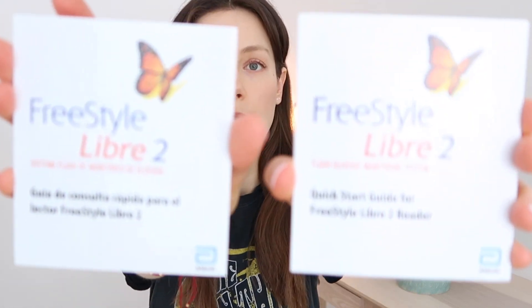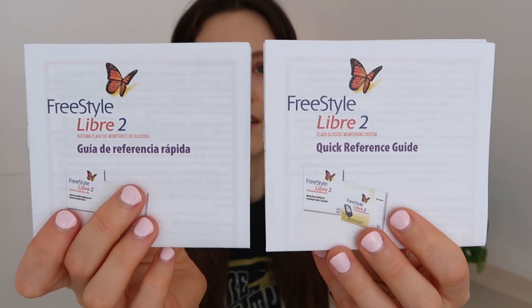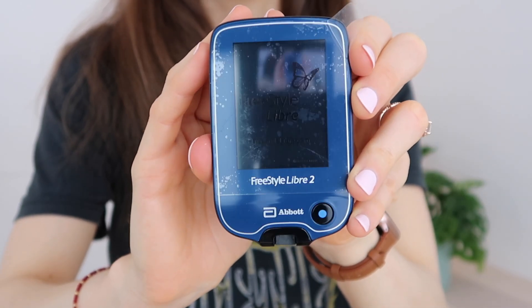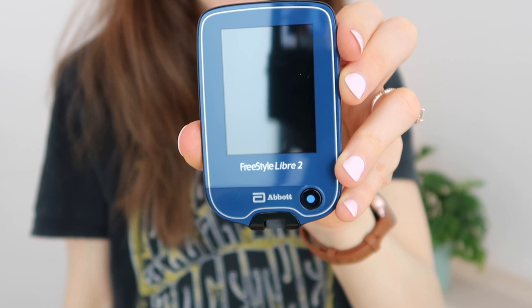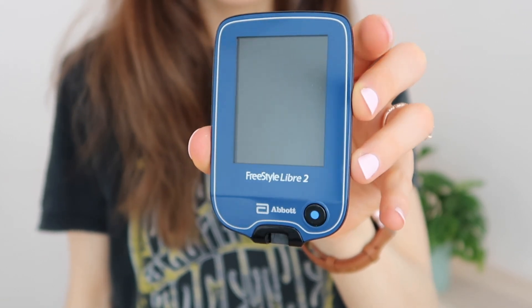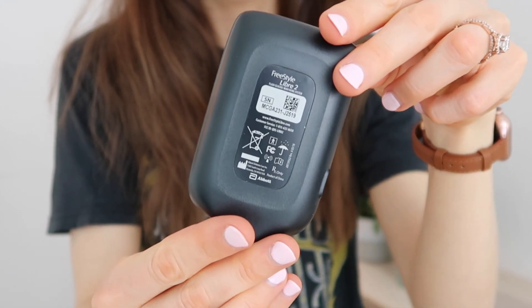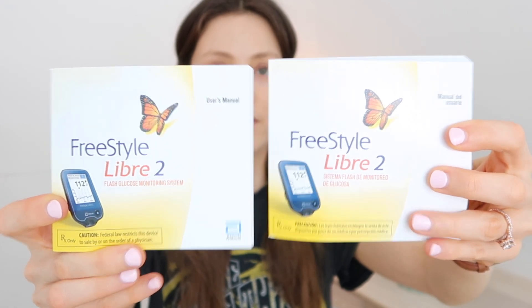Going ahead and opening up the box. We have two quick start guides, some kind of USB port insert, the quick reference guide also in Spanish and English, and here we are at the heart of the matter. We have the reader — it has a little plastic thing which I'll take off. The reader is quite a nice navy blue with a black backing. Next up we have more literature — these are the user manuals. A lot of reading material included here.